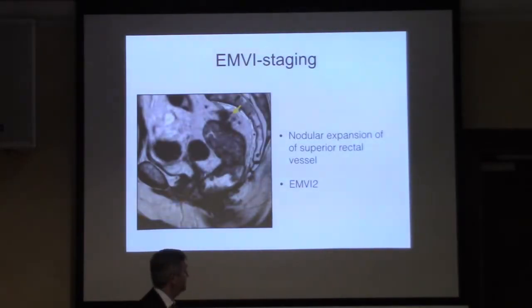So if we look at something like this, it's pretty straightforward. You know, there's a big extension of tumour, which when you scroll backwards and forwards, you can see the vessel coming down and it's in continuity with the vessel. And it's vital that you do that. You need to identify its relationships to the vessel itself, because certainly from the Mercury study, we know that N1C disease was called by pathologists, which actually the radiologists called vascular involvement. And that's because we can scroll backwards and forwards and you can see the tube coming up and down. You can see how that tumour extension relates to it more accurately than pathology. Most of the time pathology is going to be far more accurate than we can do. But under those particular things, and EMVI is vitally important, we are very good at identifying it.